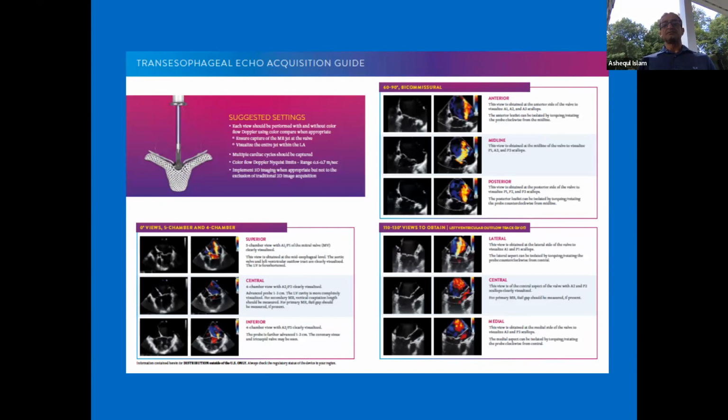So the most important views that we use during the procedure: of course, the quantitative and qualitative assessment of MR is almost always done before procedure day. A dedicated TEE is almost always done before any patient can be taken to a mitral valve procedure.